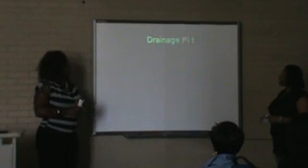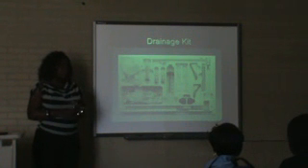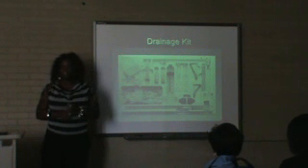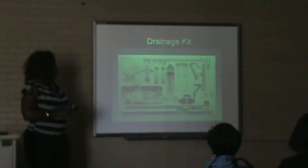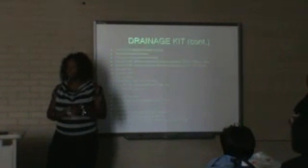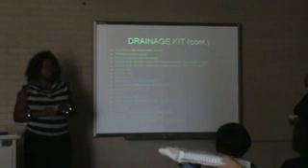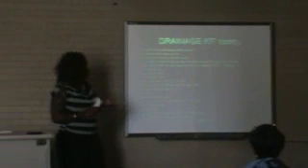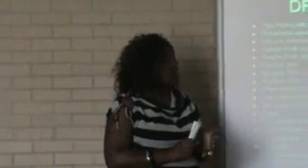At this time, we'll be talking about our drainage kit. We do have a presentation for our drainage kit. Tamika will be passing it around for you. I ask you to take the time to look at the different contents of the drainage kit, which is used for all of our percutaneous procedures. Just to give you an example of a few, we have our 5, 10, and 60 milliliter syringes, our 22 gauge and 25 gauge needles, our universal drainage set and fluid collection bag, as well as our vacuum extension set with the needle. That's just to name a few.